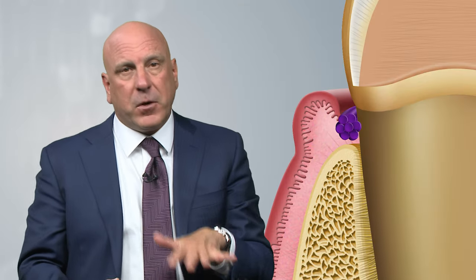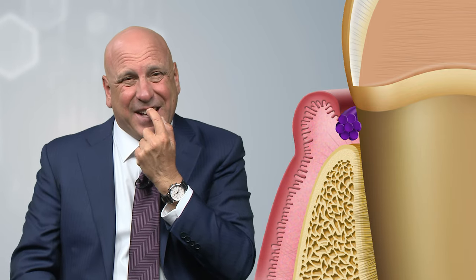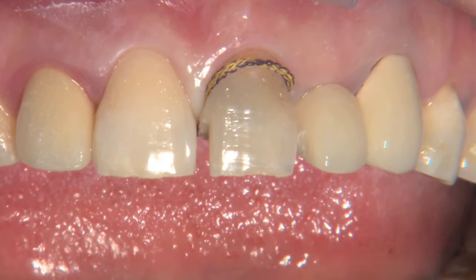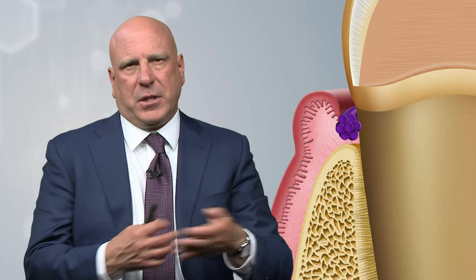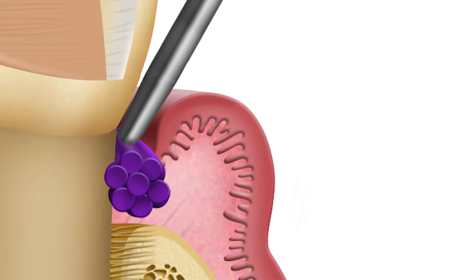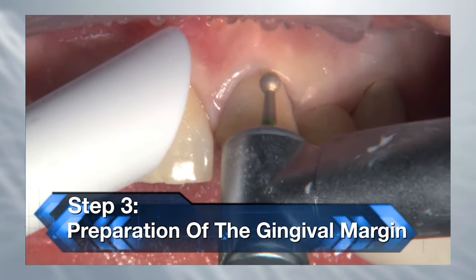This accomplishes a couple of things. The first thing it accomplishes is vertical retraction of the tissue. So on a central incisor like this, when I put a double zero chord in, it retracts the tissue apically about a half to maybe two-thirds of a millimeter, depending on the patient's gingiva, how deep the sulcus is, and the attached gingiva. That vertical retraction means I'll be able to go in and prep at that free margin of the gingiva with my round burr.